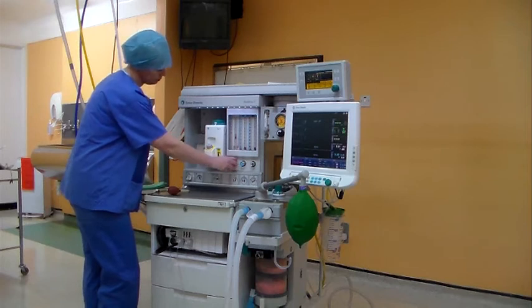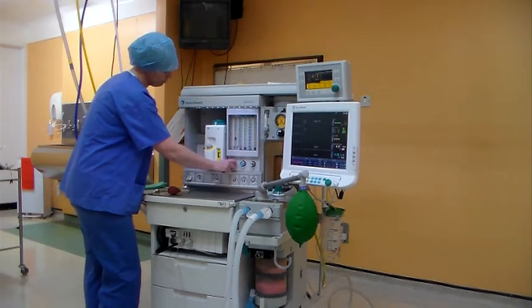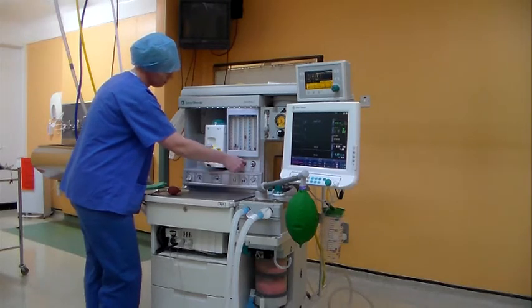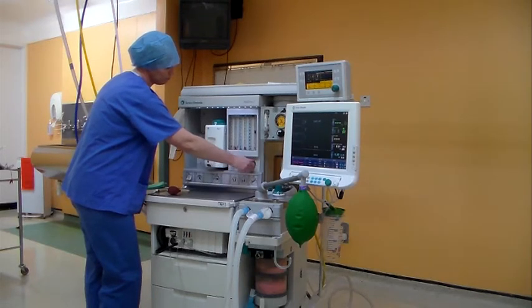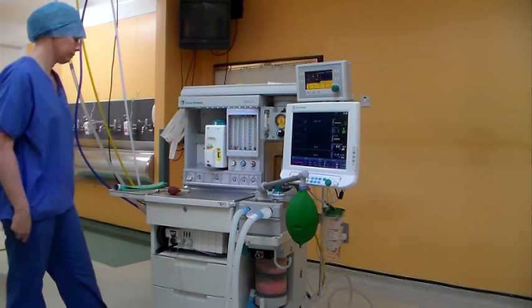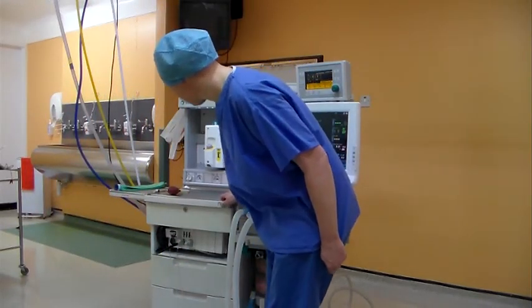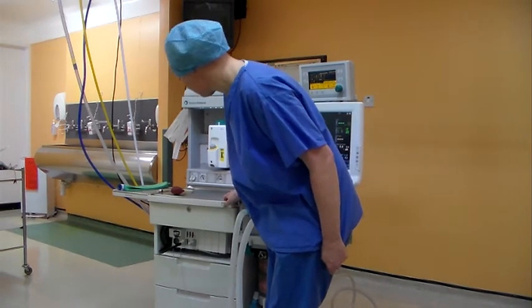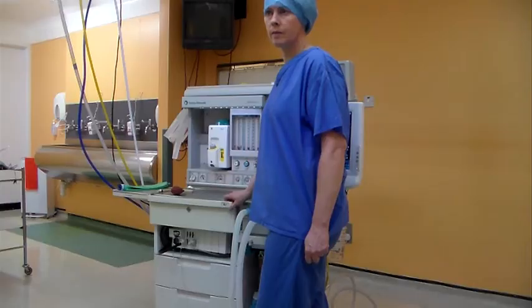Check that all flow meters operate smoothly throughout the entire range and that the bobbin moves freely. Check the operation of the emergency bypass oxygen flush button and note that the oxygen pipeline pressure does not drop significantly when it is used. Ensure the oxygen flow ceases to deliver when the button is released.